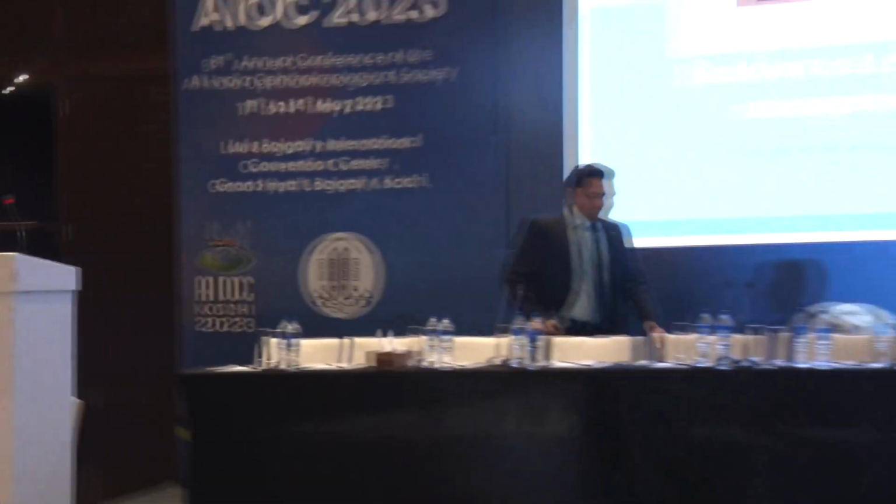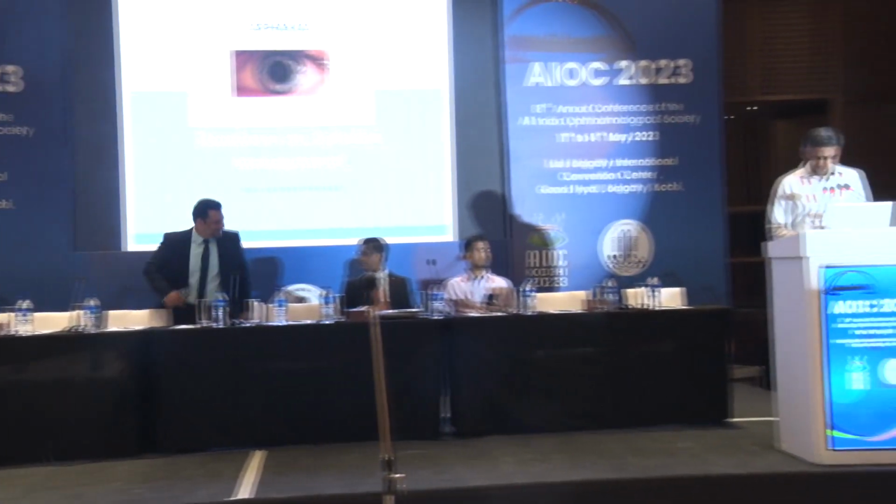Thank you, Shishir. So, aphakia treatment. The incidence of aphakia post surgery has come down to less than 1%, but still it causes a lot of morbidity to patients. Then there are other causes of aphakia in the form of congenital aphakia, trauma, dislocation of lens, or hereditary disorders. So, how to treat it? There are different options in the form of spectacles, contact lenses, intraocular lens, or refractive corneal surgery.